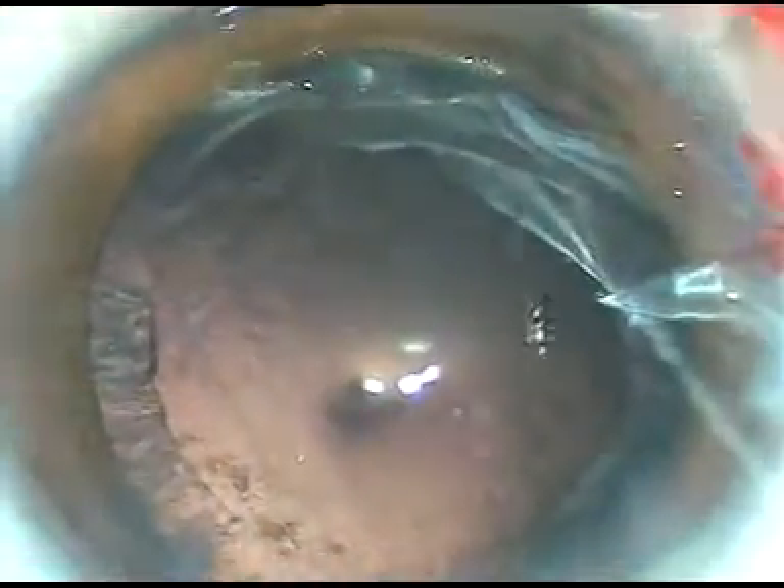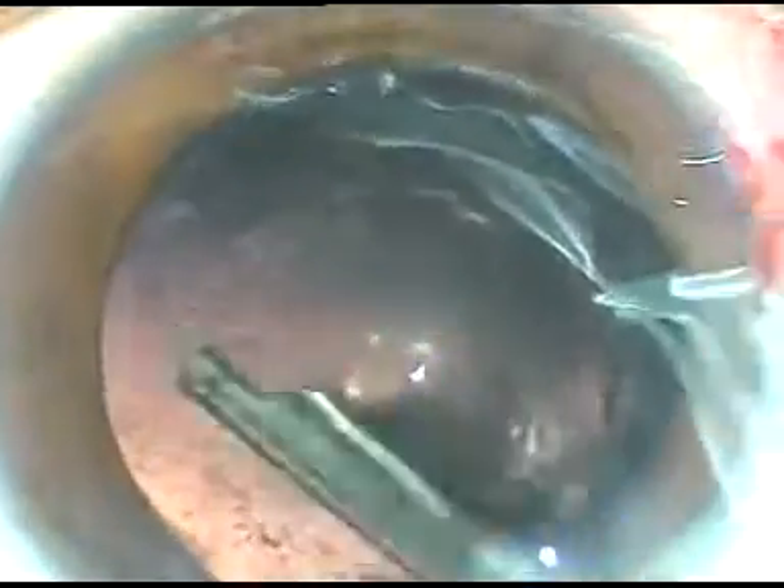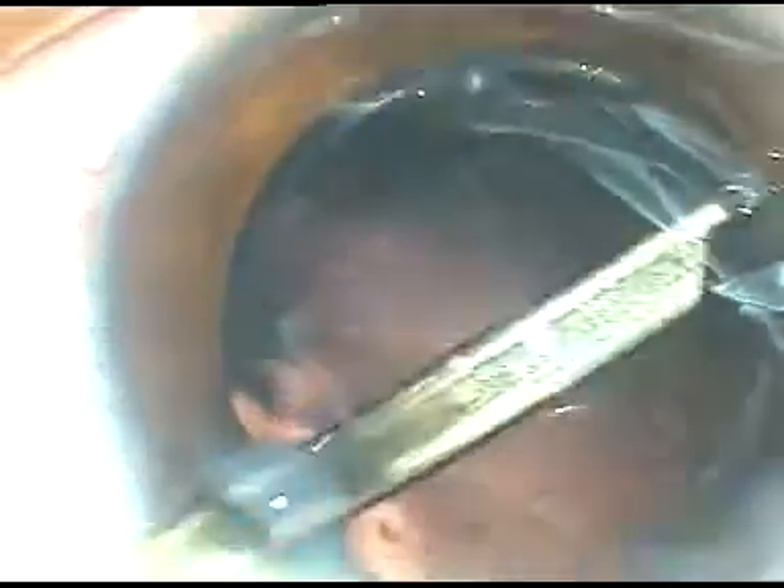Let us see how to clean this cortical matter. First, I am going to use a Simcoe cannula — this is a 23-gauge Simcoe cannula from Appasamy Associates, a very nice, thin, slender Simcoe cannula. I have also got a coaxial I/A from Los Angeles, and I am going to use that very soon.